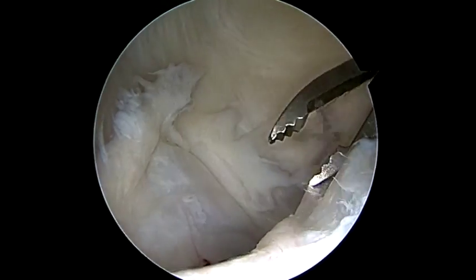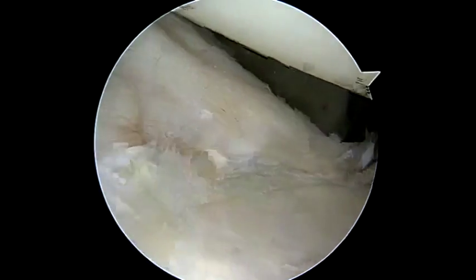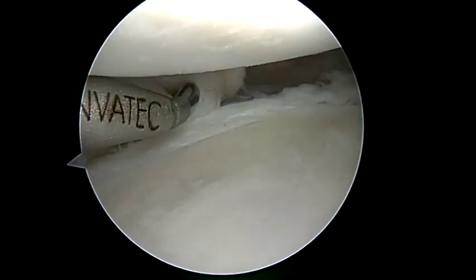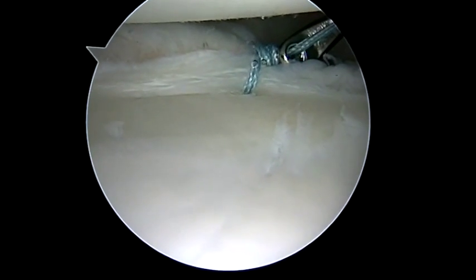A Kingfisher is introduced through the anterior portal created in the center of the rotator interval. The avulsed capsule is mobilized proximally until normal tension is restored in the anterior band of the IGHL. We then place a temporary reduction stitch to hold the capsule in an anatomic position during suture anchor repair.